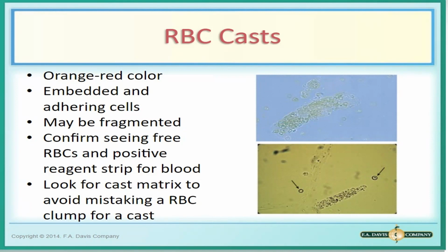Kaya lang po siya naging RBC cast. Katulad ng example ko kanina, for example, may bleeding, so may RBC na dumadaan within the tubules, matatrap sila, nagkakaroon ka ngayon ng RBC cast. Okay? Glomerular damage seen in conjunction with dysmorphic RBC and increase in protein. Tubular necrosis seen in conjunction with renal tubular epithelial cell.